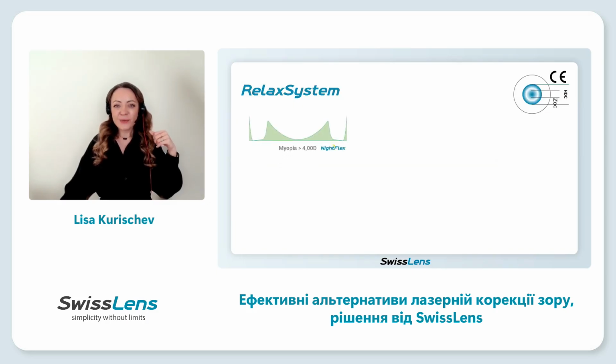Okay, and now let's talk about ortho-K lenses, Night Flex Relax. We know how it works actually. So let's take this case. For example, here you can see we correct, for example, -4. So we expect, of course, in the periphery, +4.